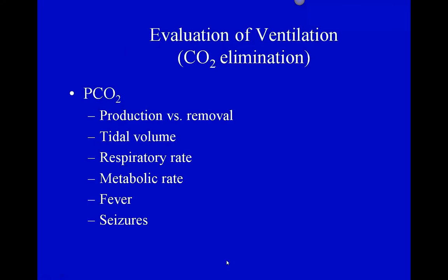When we evaluate ventilation, when we look at a blood gas, we're going to focus on the pressure of carbon dioxide. And the pressure of carbon dioxide in the artery is determined by your ability to eliminate CO2, the balance between production versus removal of that carbon dioxide.